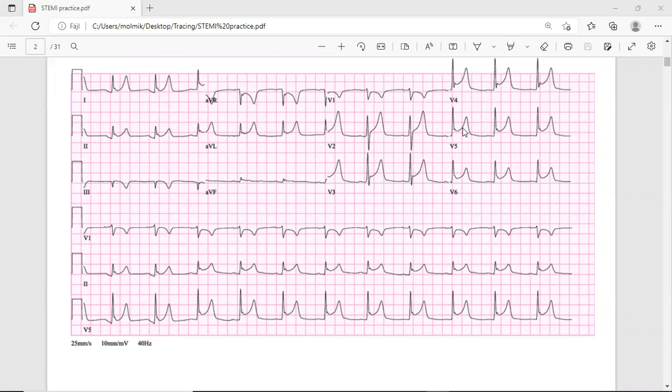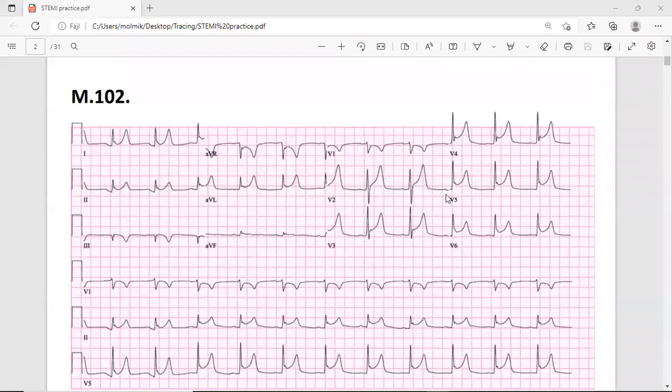Okay. And then I found the ST elevation, and I suspected that it was a subepicardial or transmural lesion at the acute or hyperacute stage, but again, a bit confused about that. No, don't be confused. You can translate the ST elevation to hyperacute MI. You don't need to use transmural or subepicardial lesion. You can use ST elevation MI or hyperacute MI, that's it, period. You don't need to go for the pathophysiological conditions or pathomechanism of why we have an ST elevation. Say only that if you have an ST elevation, that's indicative of a hyperacute MI or STEMI. That's it.